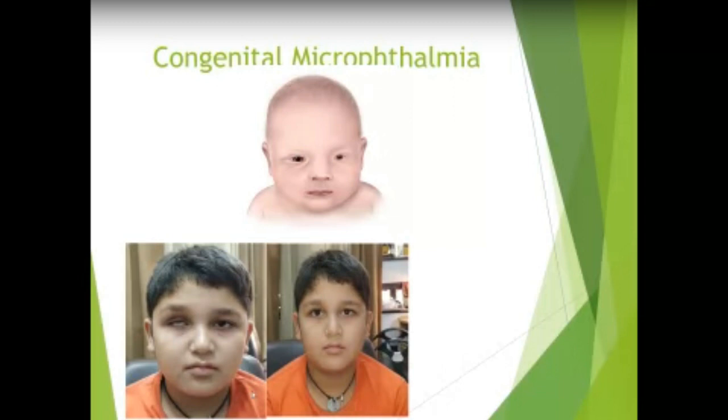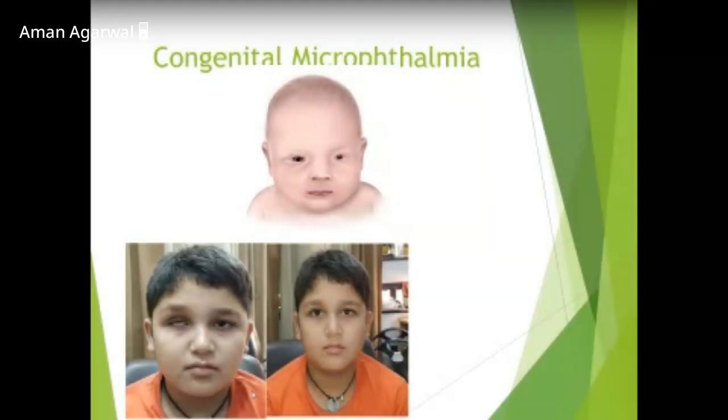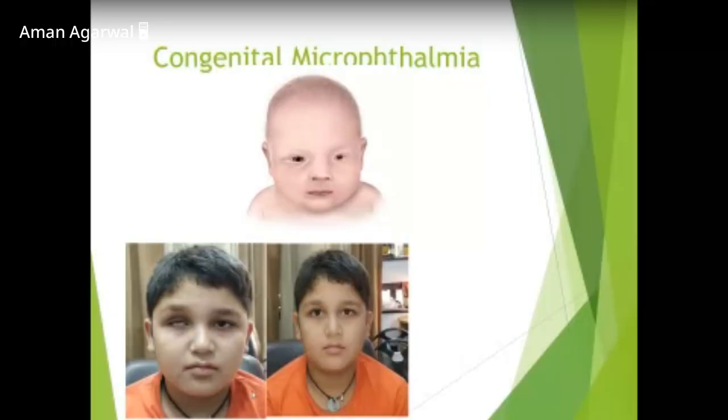Basically, we will be doing our treatment in anophthalmia and congenital anophthalmia for children with severe microphthalmia, usually to stimulate hard and soft tissue growth of the orbit, to reduce any asymmetry of the face as much as possible as the child grows into adulthood.